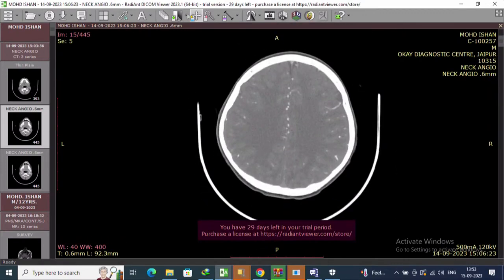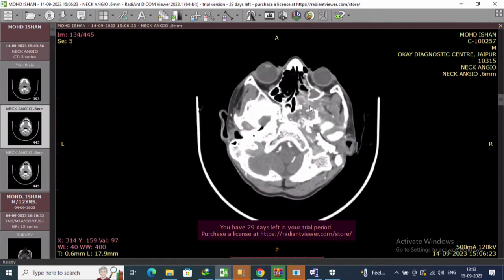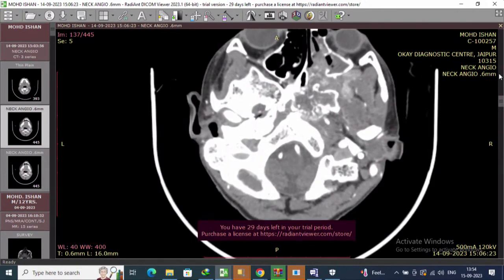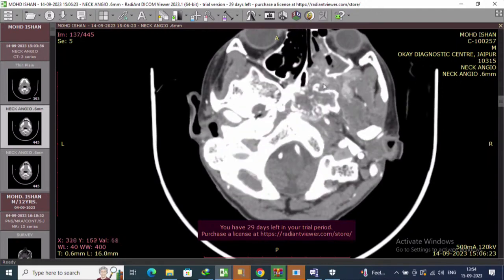Now, the abnormal finding that I found in this case was, see, this is in the axial section. Look at this. This is the pterygopalatine fossa, normal pterygopalatine fossa on the opposite side. Yes, see sir, this is the posterior wall of maxilla. This is the pterygoid process. This is pterygopalatine fossa. And look at the pterygopalatine fossa on this side. Can you see? Yes, sir. Completely widened. This is the maxillary sinus wall which is pushed anteriorly. Holman-Miller sign. Yes, and this has widened the pterygopalatine fossa.